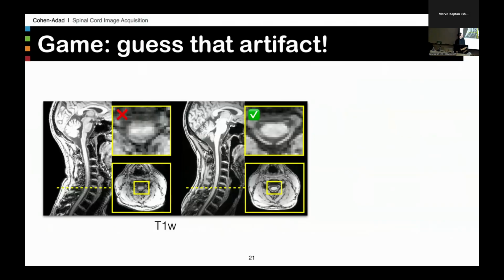I would tend to favor, in this case, a more pulsatile motion, because we see patients where there is a narrow spinal canal, and the cord is actually pulsating quite a lot, and it appears pretty well in the MPRAGE image. So it's possible that there was also respiration and subject motion, but I think there is also quite a lot of spinal cord pulsatile motion.